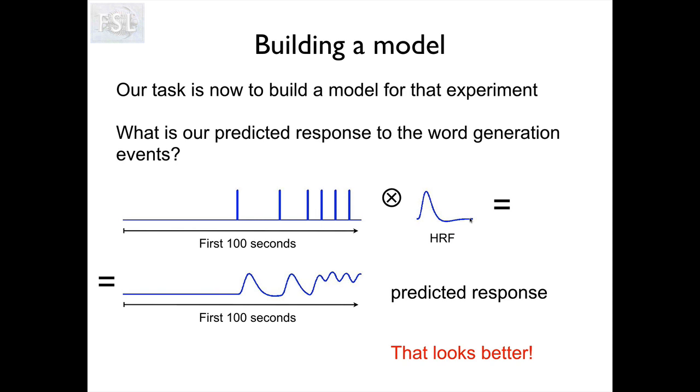What people did then was they simply would present a very brief visual stimulus, for example, and look in the visual cortex and see what happened there. Or they might present a very brief auditory stimulus like this, and then they look in the brain to see what the auditory response looks like. And it turns out that it looks something like this.